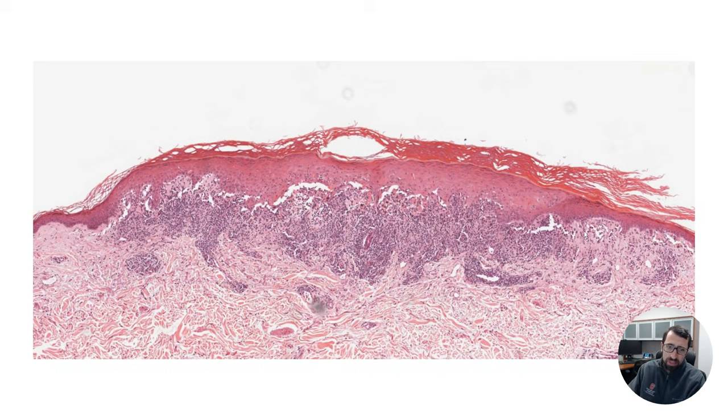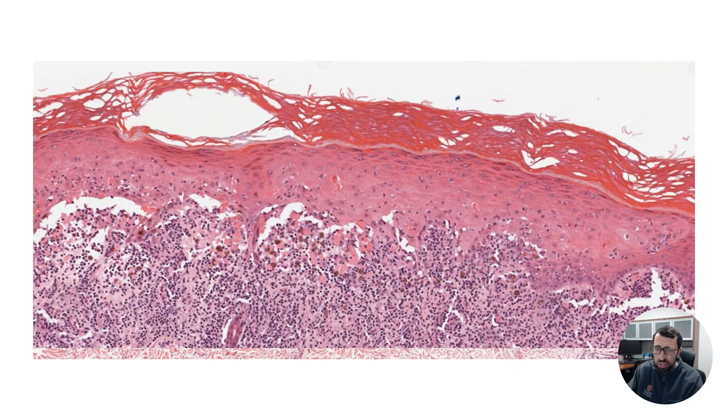This is the same exact thing. Lichenoid lymphocytic infiltrate, you can see it's disrupting the dermal epidermal junction. You can see dead keratinocytes even falling here into the dermis. What's different about this is you can see that this is a lesion. This is a papule rather than the rash, because flanking this on both sides is completely normal epidermis to the right and then to the left. So it's a lichenoid lymphocytic infiltrate, so it's like lichen planus, but it's one lesion.